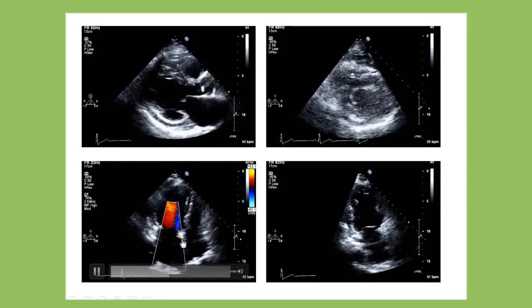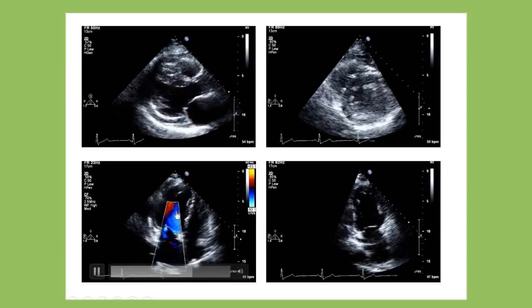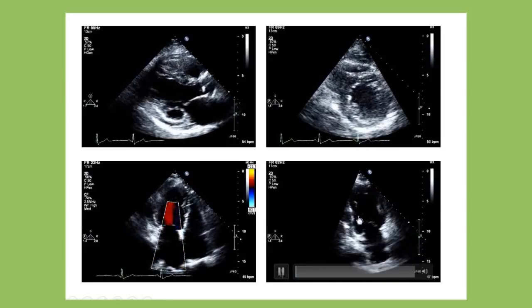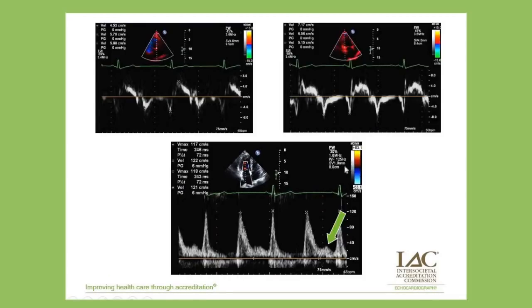She has very little mitral regurgitation. And in this two-chamber view, and again, I apologize, this is Mayo format, so this is the left side, you can see the infarcted area. So we know she's had an infarction. We look at the tissue Doppler. This is the septal. We have sort of a reverse or an abnormal relaxation pattern here in the sense that the E prime is less than the A prime. Lateral wall, not so much.